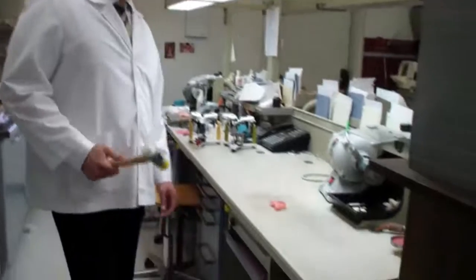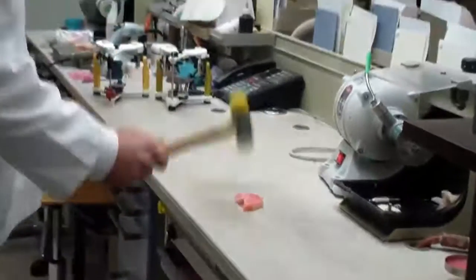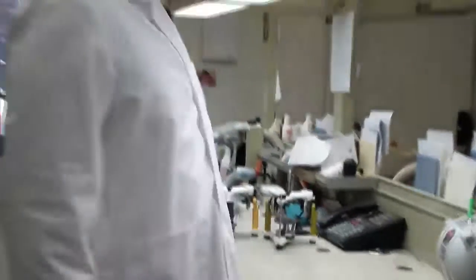Next we have our SR IvoCap Precision Injected Denture, and we're going to see how this mans up. Unfortunately that one broke in one shot too.